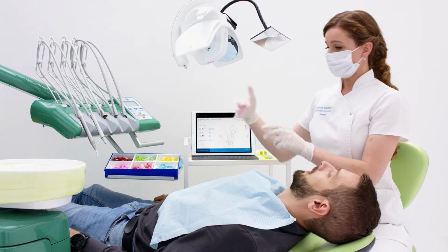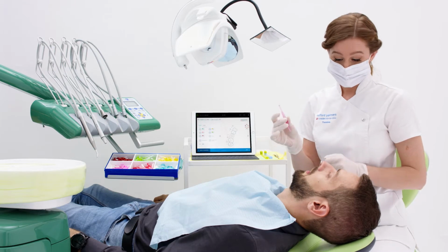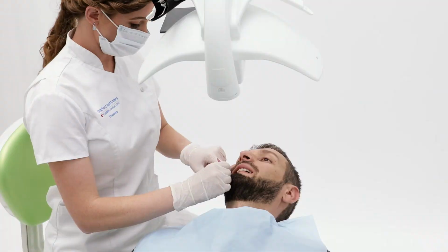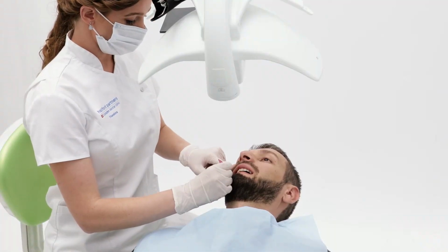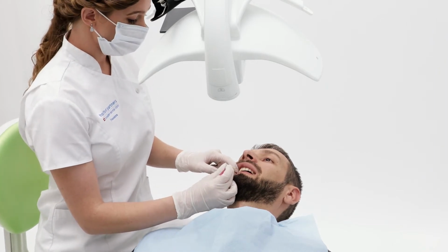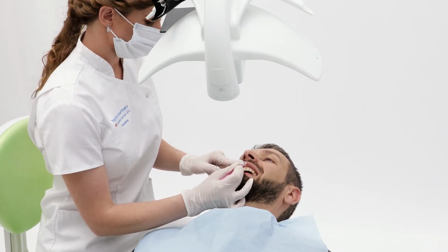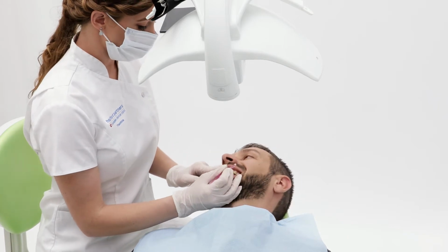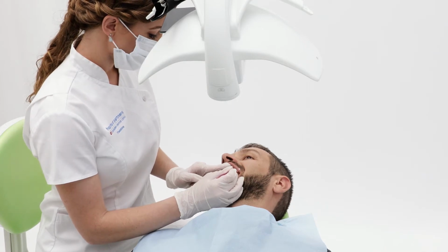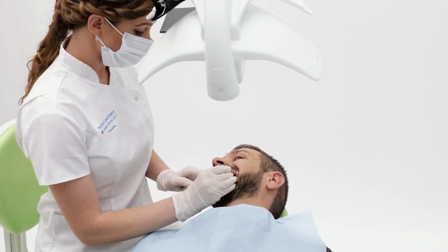I then start a new Bob score. I will complete this Bob assessment using the IAP mental method, which will take me approximately 1 minute to complete. I complete the full assessment with the Prime and Perio IAP. I use the IAP moving continuously from sextant to sextant, and whilst doing so, I am taking a mental note of the 2 most frequent colours determined by the IAPs used.